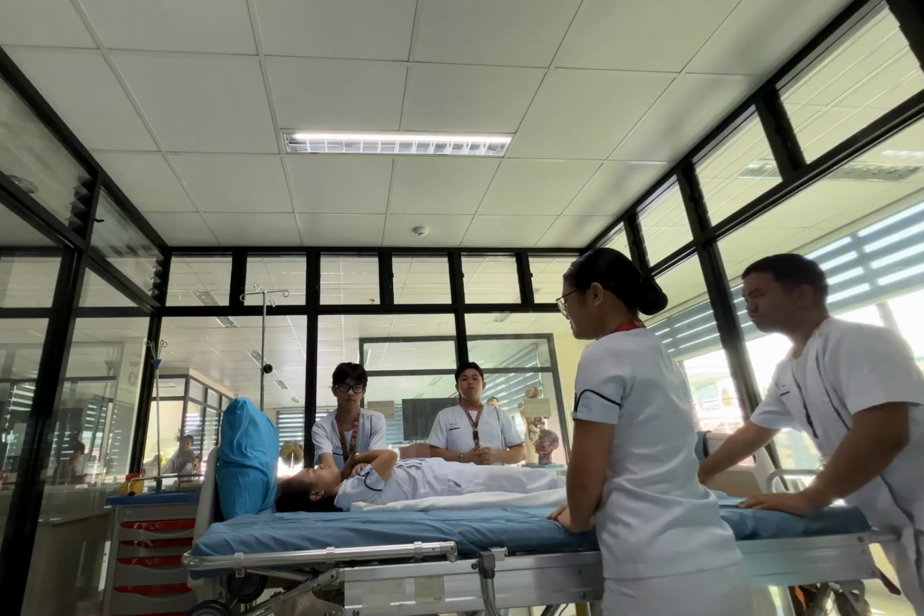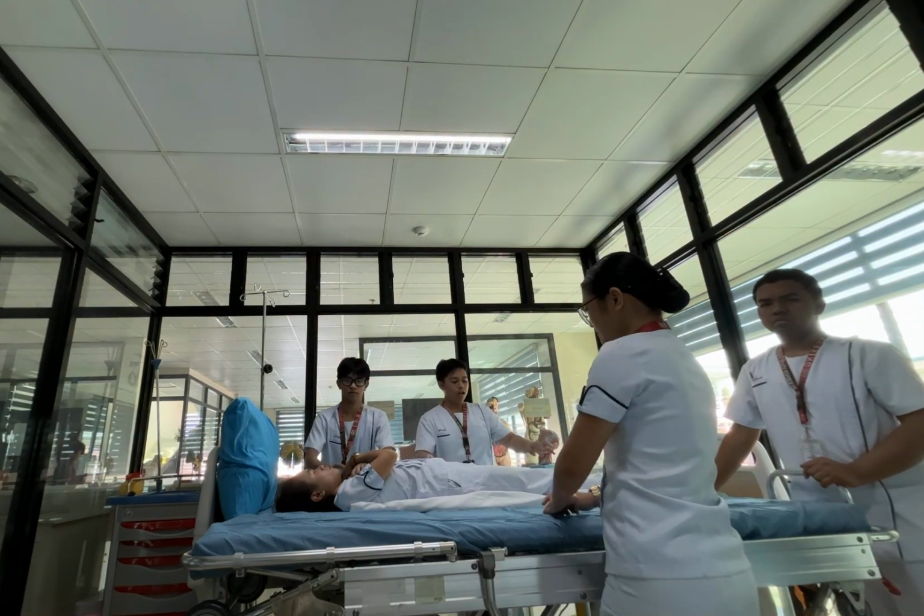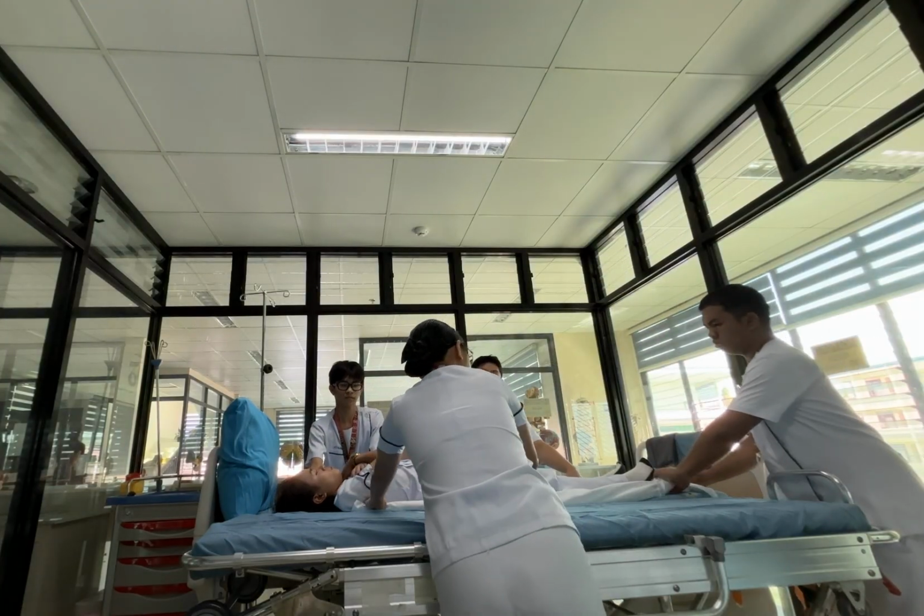And after that, once the patient is transferred to the stretcher, raise the side rails on both sides of the stretcher. So now we will be doing the transferring of the patient to the stretcher.